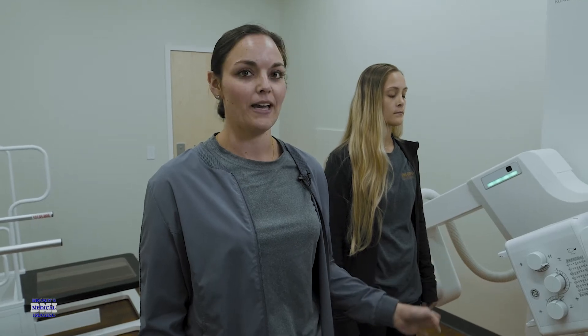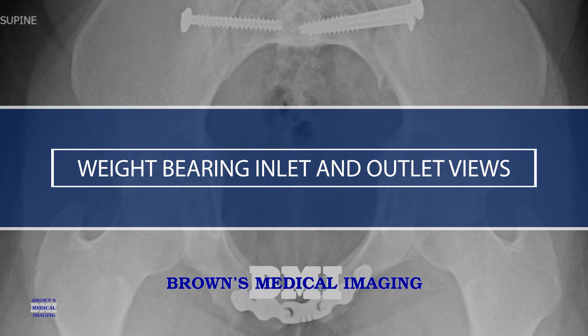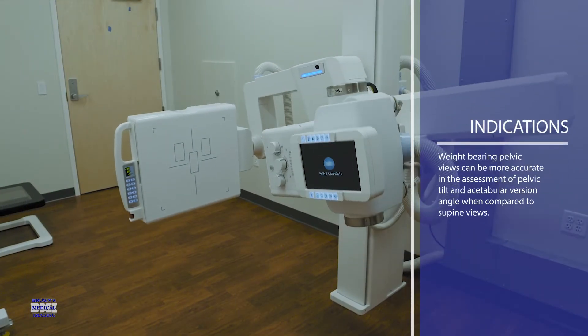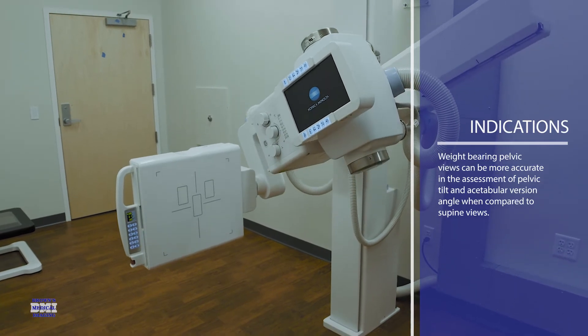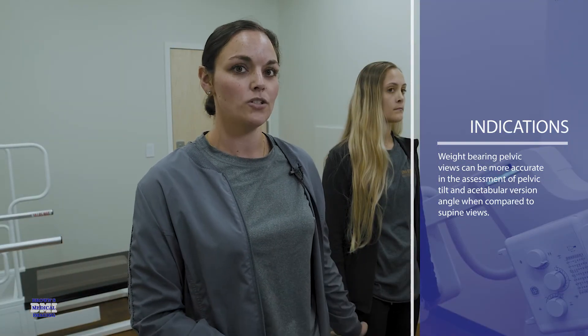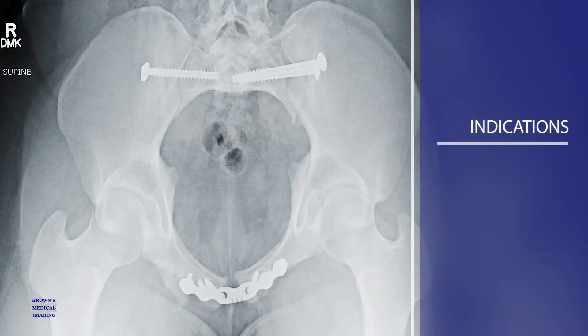We're going to do an inlet and outlet x-ray on the U-arm. This is much easier than the traditional laying down method, because laying down you have to angle cephalic and caudal. With the U-arm, you can just have your patient stand, turn around, and leave one caudal angle on.